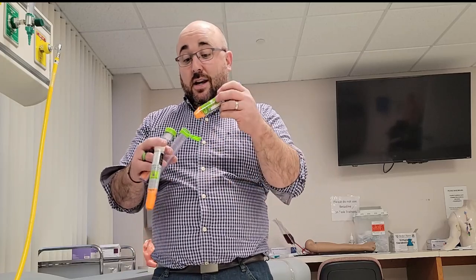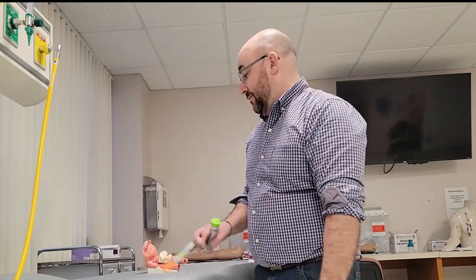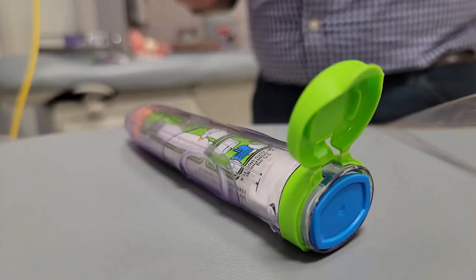That will actually decrease and slow down the allergic reaction. They always say to have two of them in case one doesn't work or only mildly works — you can always take a second. I'm going to show you today what it looks like when I activate one of these and the needle comes out.